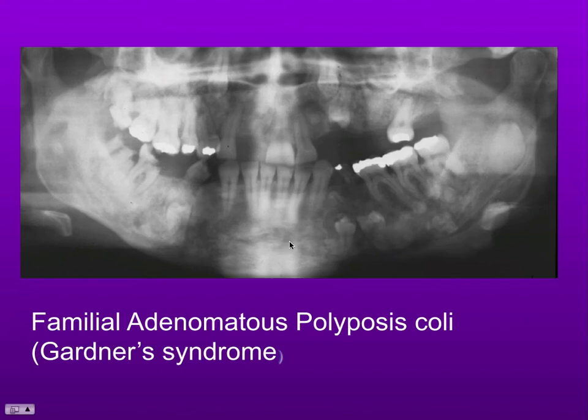Multiple osteomas, benign tumours of bone, both externally with lumps developing and internally patchy radiopacity, failure of eruption of teeth, sometimes supernumeraries and odontomes.